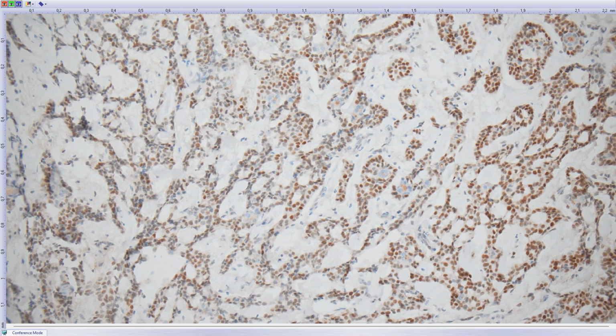when we get this differential diagnosis, we have to confirm by molecular studies, because adenoid cystic carcinoma is quite indolent, but in the long term an aggressive and deadly cancer. So I have performed genetics, and it came back with a very classical MYB-NFIB rearrangement, the most common type. So my diagnosis is adenoid cystic carcinoma, probably from the parotid gland infiltrating through the duct into the oral mucosa.